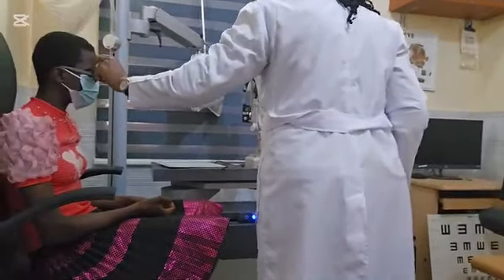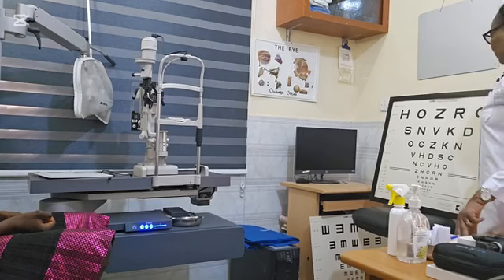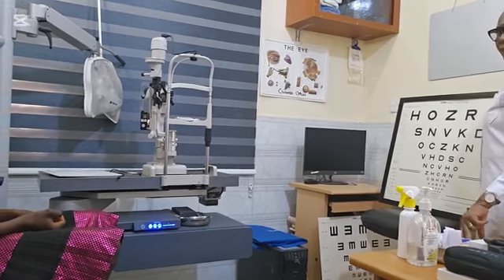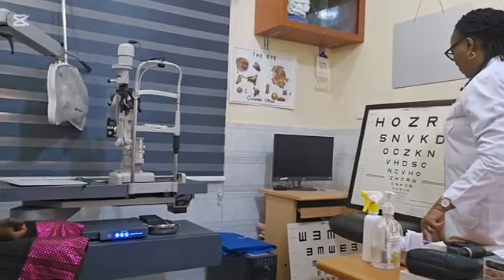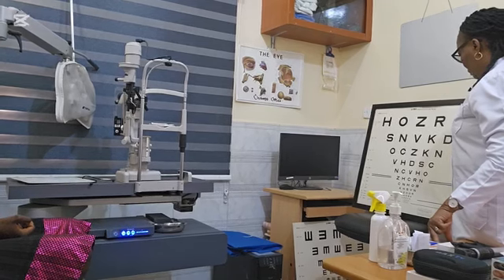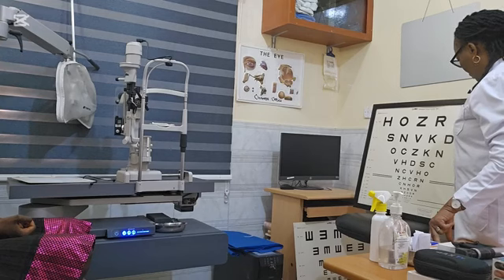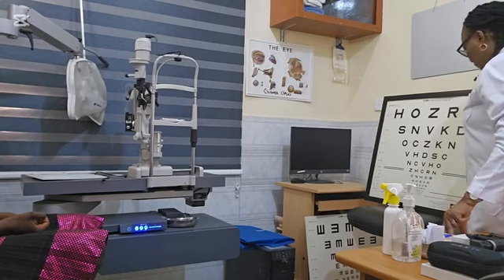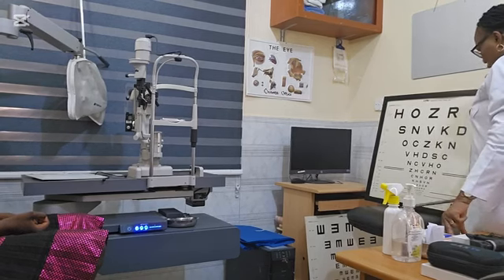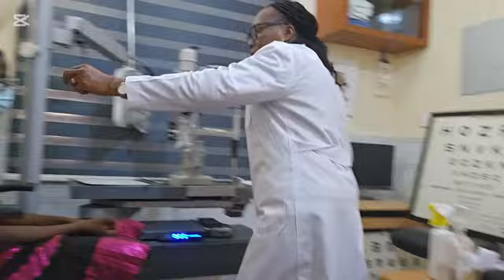Let's go to the left eye. Read again from the beginning. HOZRC. SNVKD. OCZKN. VNDSC. VNZVN. Okay, the VA noted monocularly.